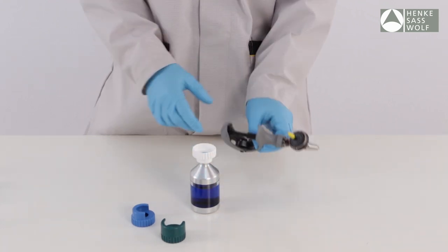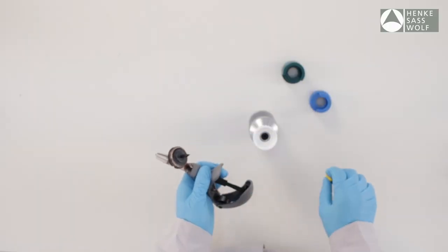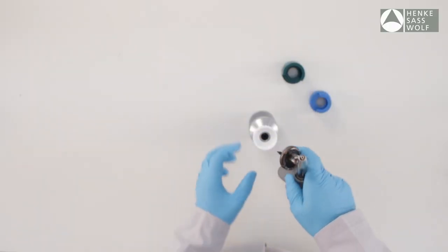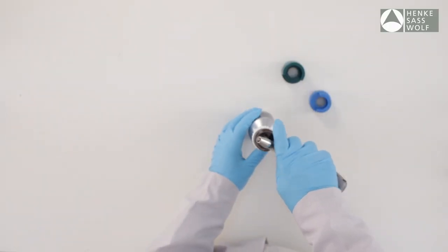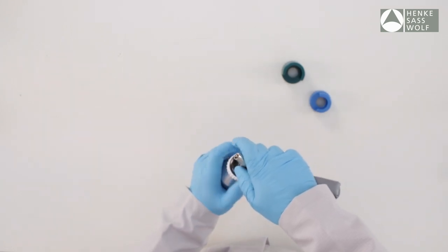Insert the bottleneck into the universal adapter. Take off the security cap of the syringe. Stick the spike into the center of the rubber cap of the bottle. Turn the bottle with the corresponding adapter until it is secure.